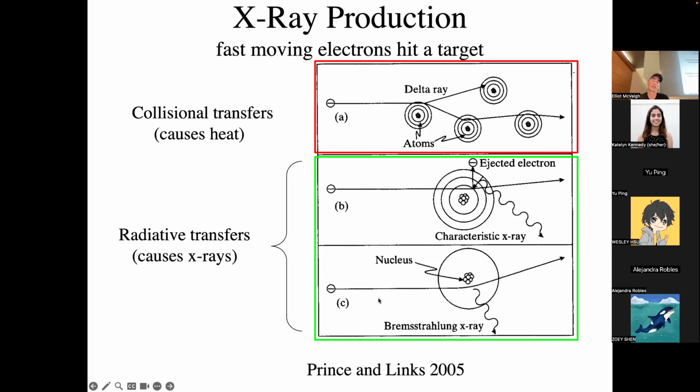most of the X-rays that are produced by this process, which is called Bremsstrahlung or braking radiation. It's German. And what happens is the electron flies by a nucleus and it gets close enough to the nucleus to interact with it in some quantum mechanical way. It doesn't have to hit it. It just gets close into its orbit such that some quantum mechanical way it says, "Oh, I've changed my energy and momentum to go this way," and it produces a photon, right, from that radiation.